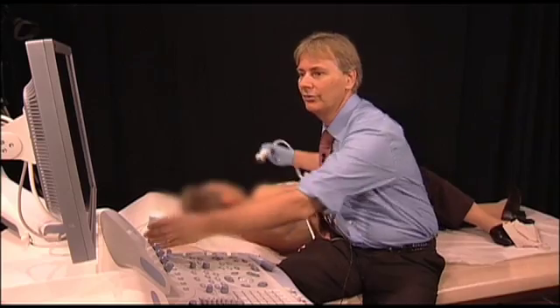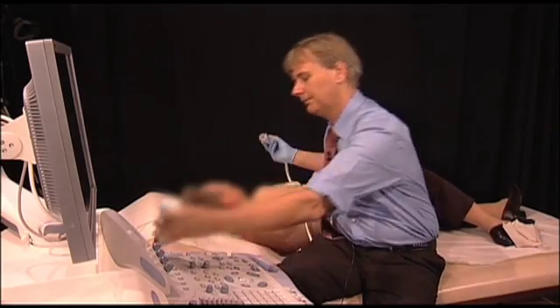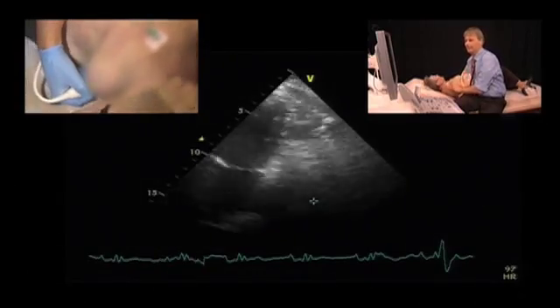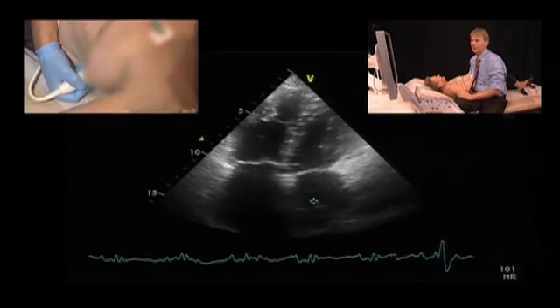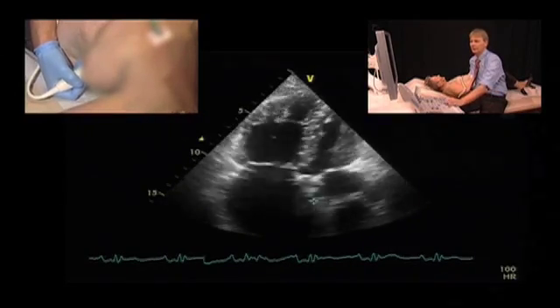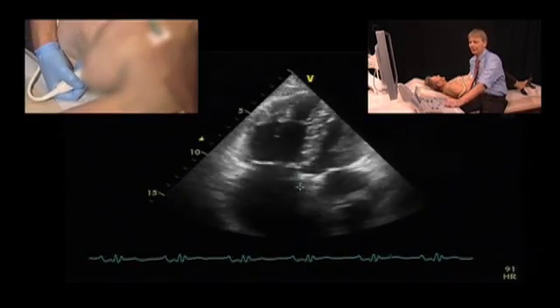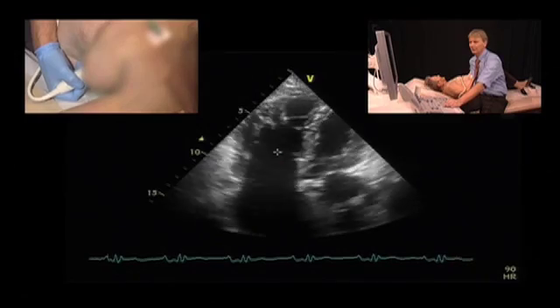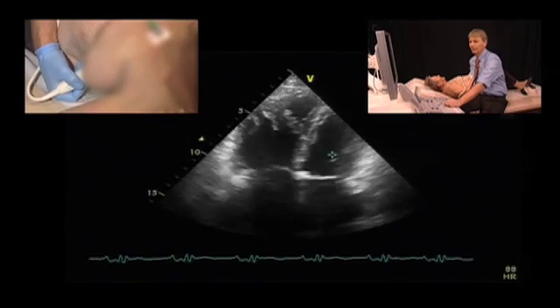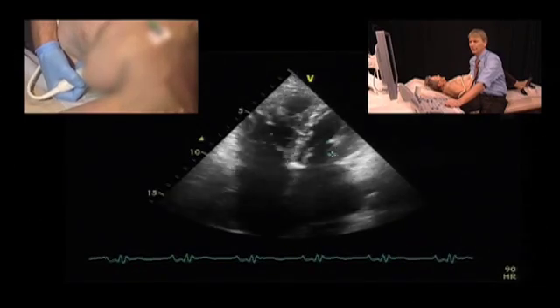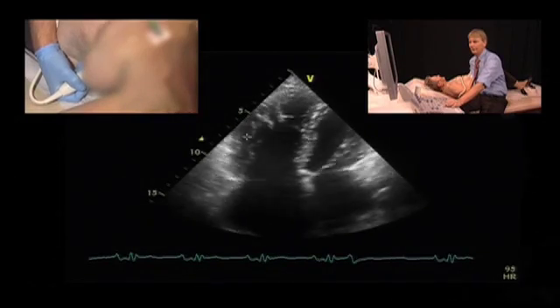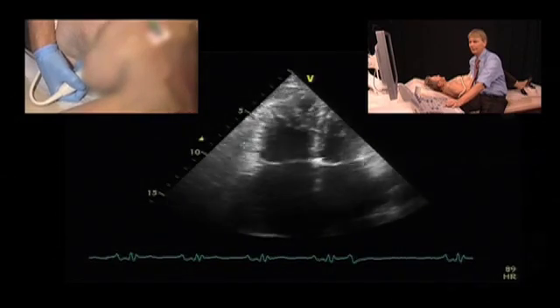If we go to the apical views, the four-chamber view, we see a dilated right ventricle, especially when you compare it to the left ventricle. We also have right ventricle hypertrophy here.